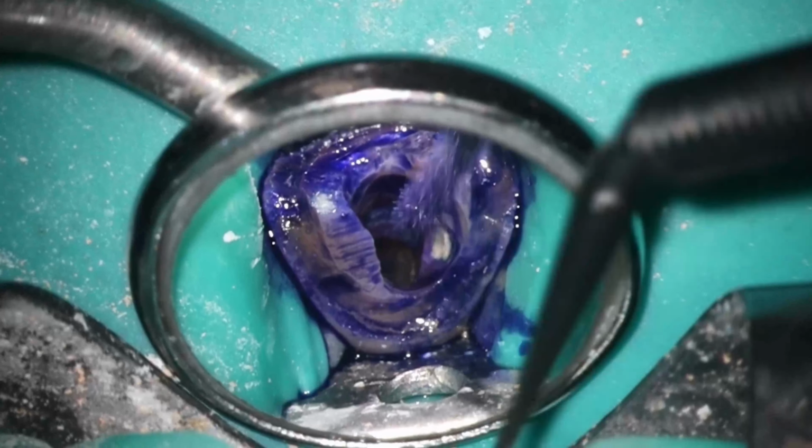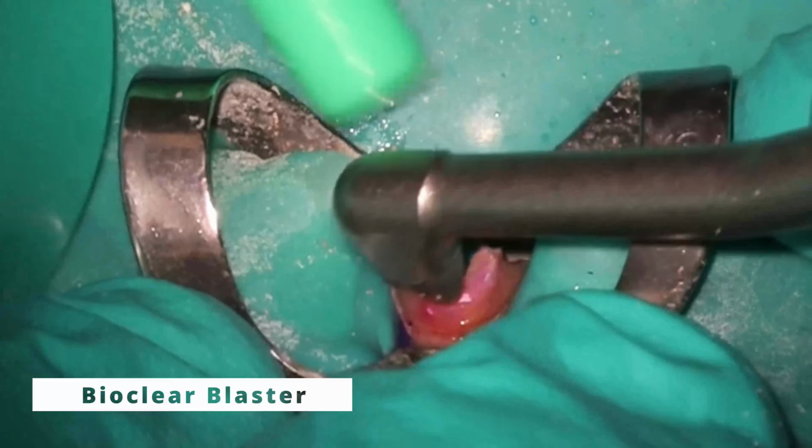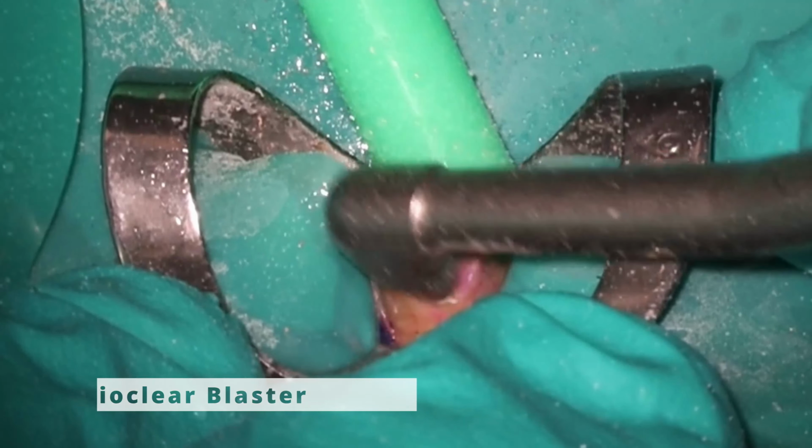So what we're doing here, going through with the disclosing solution. As you can see, a little bit more bacteria than you'd expect, but it has been exposed to the oral environment.